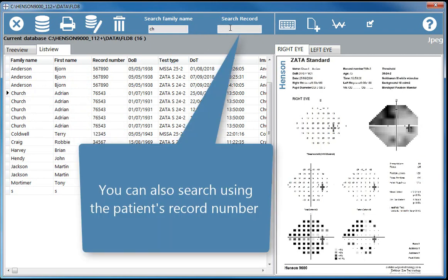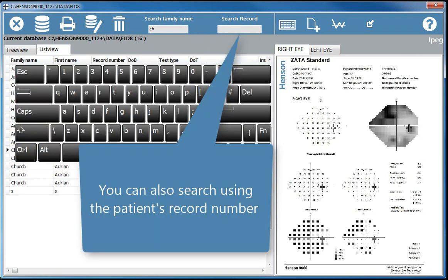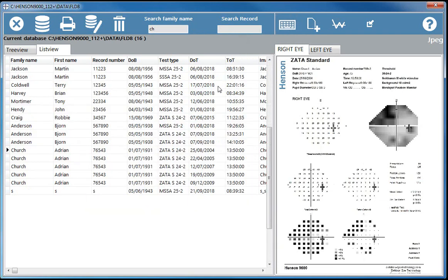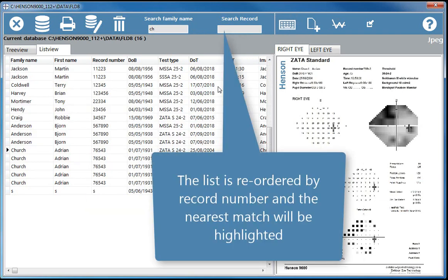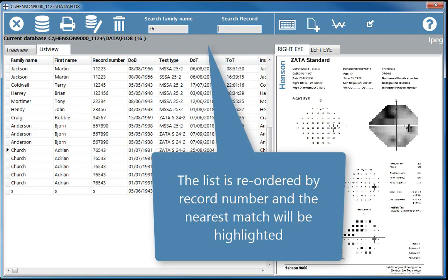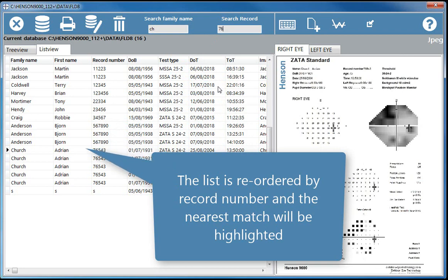You can also search using the patient's record number. The list is reordered by record number and the nearest match will be highlighted.